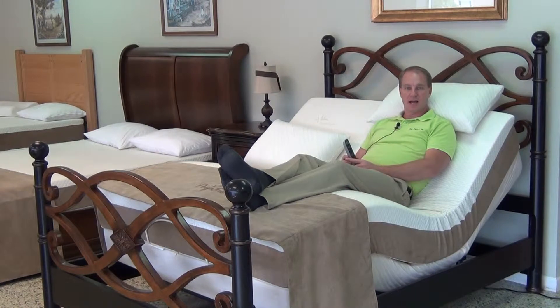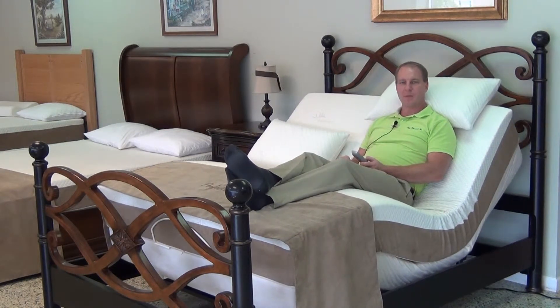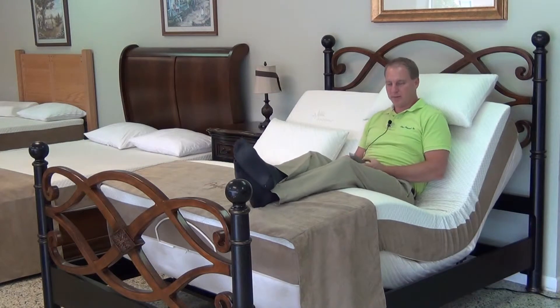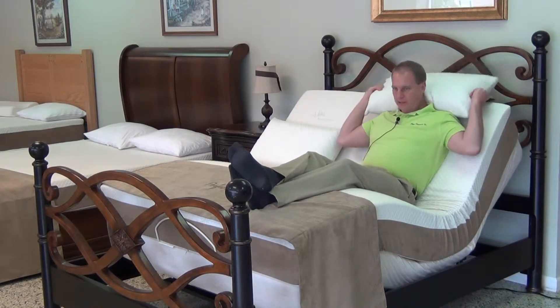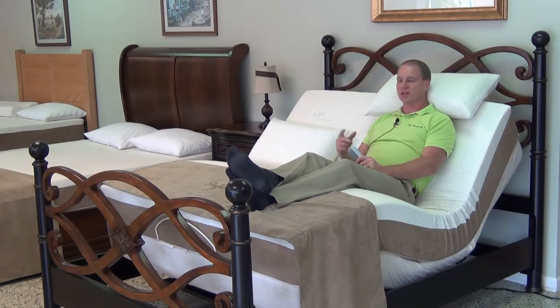This particular model has full leg and head articulation. I actually can raise the head up a little bit further as you'll see. Putting the head all the way to the top position, of course, is great for reading, working on a laptop, watching television.